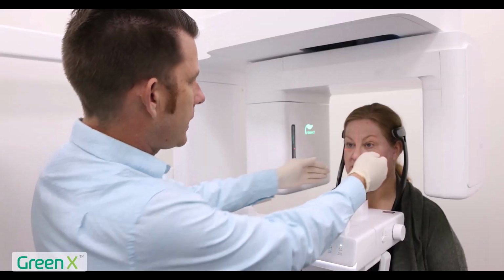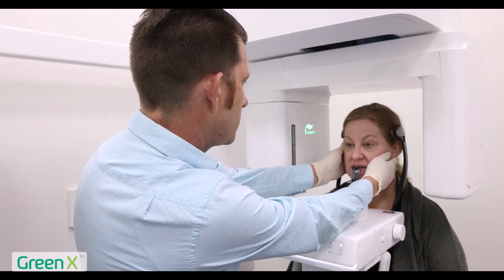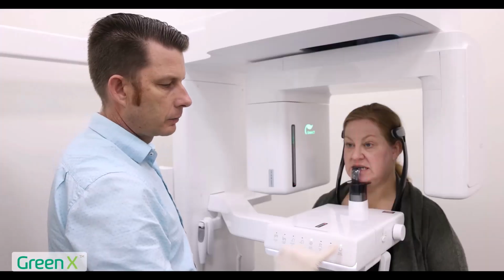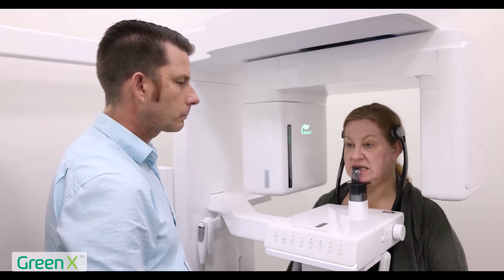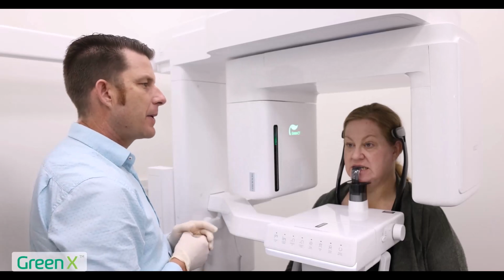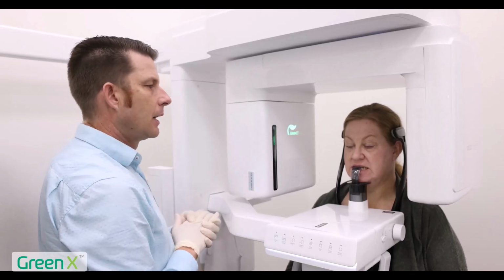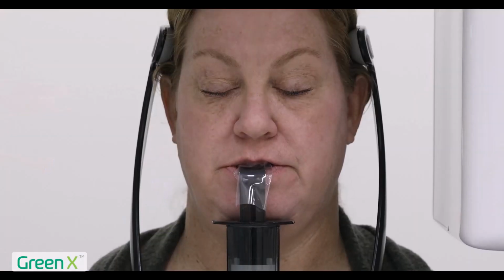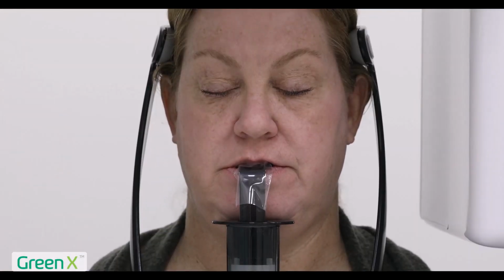Next, I'm going to double check and make sure the patient's lined up center. I'm going to go ahead and select my ready return. The system is moving into image capturing position. Please wait. When we're positioning for our panoramic image, I'm going to have my patient close their eyes, close their lips around the bite stick, and also swallow and keep the tongue flat to the roof of the mouth.